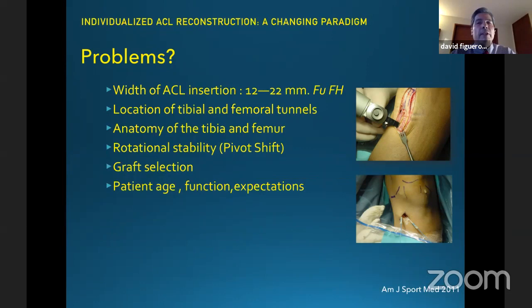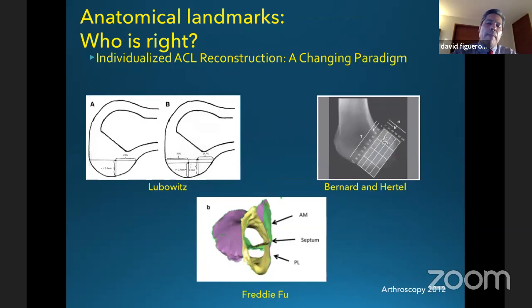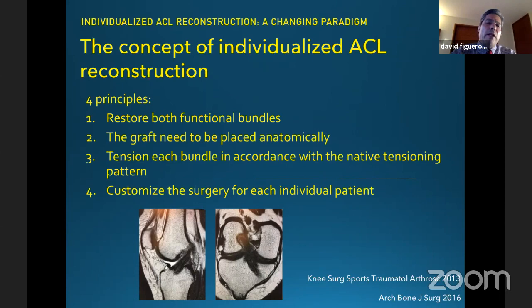If we look at the anatomical landmarks, we need an individualized ACL reconstruction. Have a look at the papers of Lubowich, Bernard and Freddie Fu, but who is right? You can see different approaches to looking for the anatomical position. And this was born many years ago, one new concept that they talk about: the individualized ACL reconstruction.